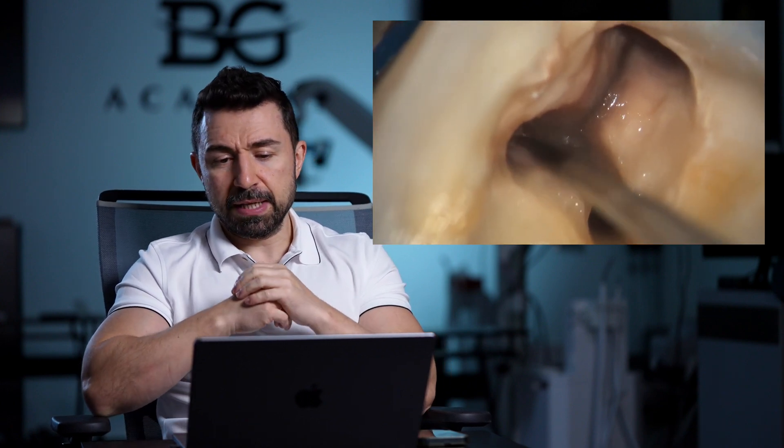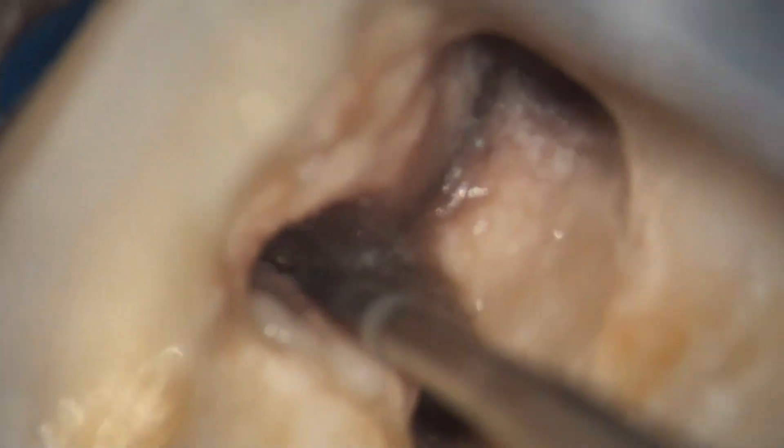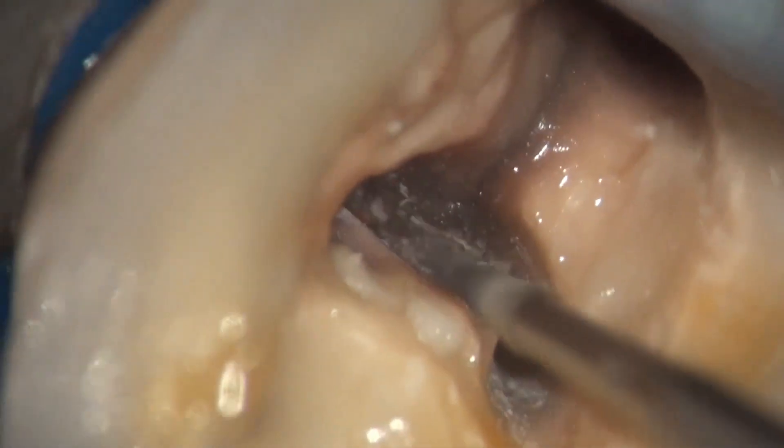Here you can see how I use this carbide thin bur, which is usually used for minimally invasive fissure tommy. We are doing the instrumentation of the isthmus with this bur.